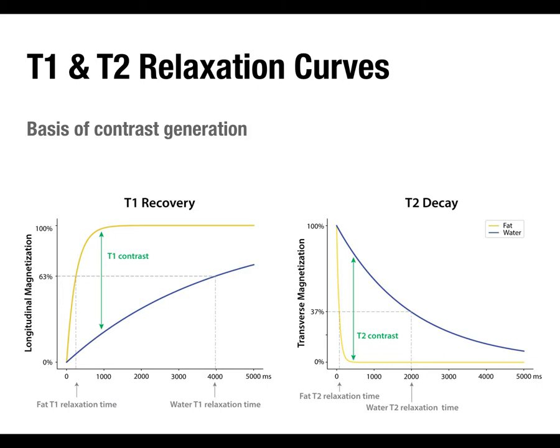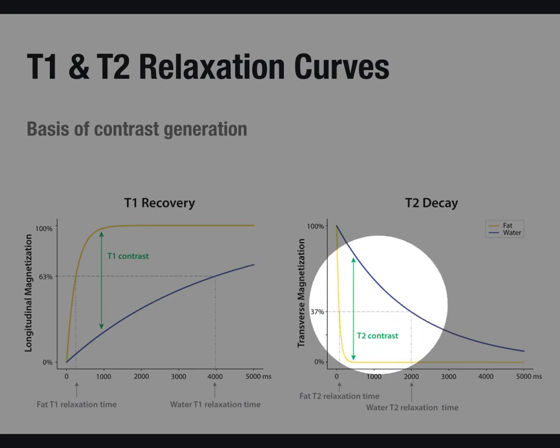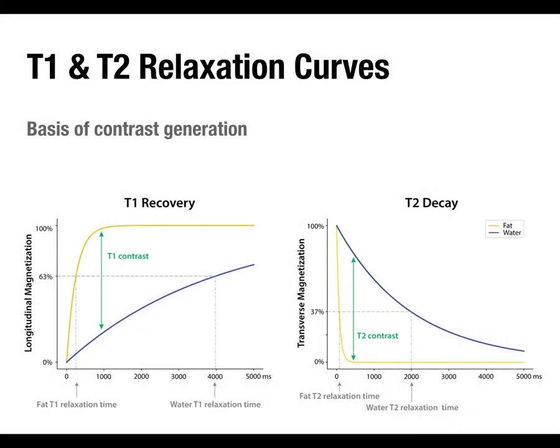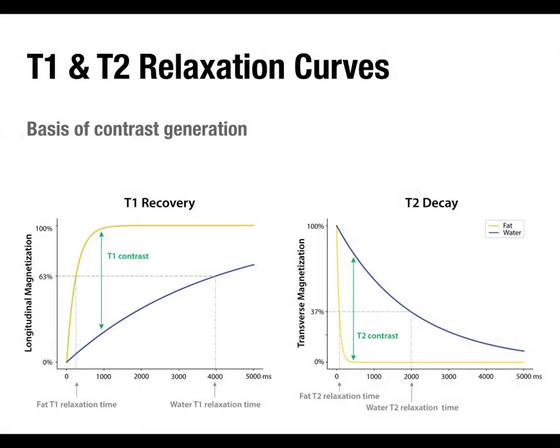And even in a good structural MRI image, as you zoom in, you can see contrast within the white matter and within the gray matter, just depending on the density of stuff that's in there. And basically the same thing for T2 here is you want to find the decay time where you're maximally separating the fat and the water signals. And that all comes from smart physicists who know how to actually do the math to calculate these curves and so on.